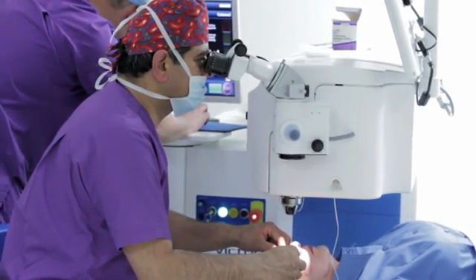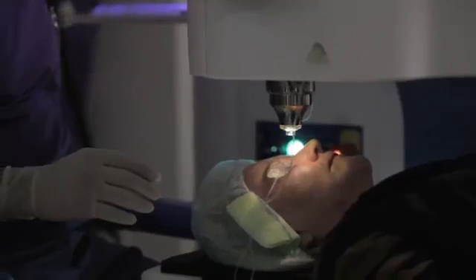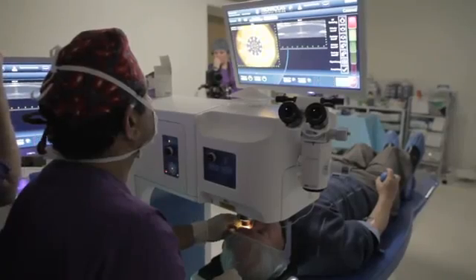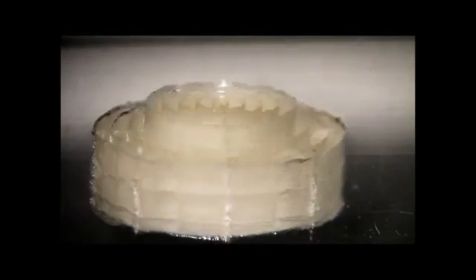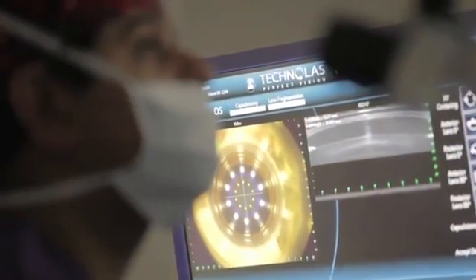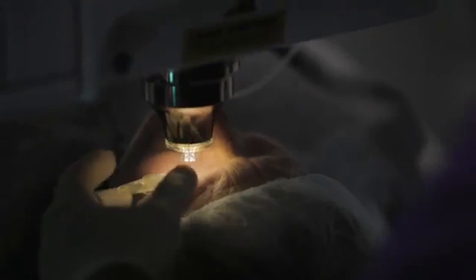The ability to now image the anterior segment to a high level of accuracy has enabled use of the femtosecond laser in anterior segment surgery. This provides a major step change in cataract surgery, especially for performing precise capsulotomy as well as lens fragmentation, as demonstrated in this acrylic model. The ability to effectively fragment the lens, including very hard nuclei, allows rapid removal of the cataract.